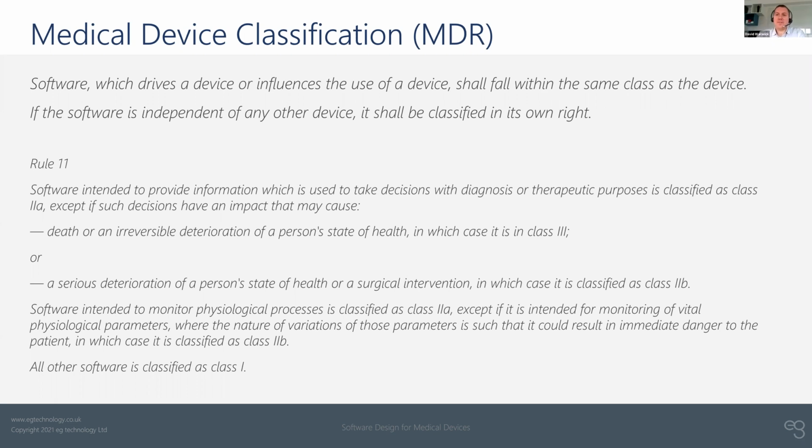I'm going to contextualize my question. I'm not actually working on a specific solution, but I am an entrepreneur amplifier. So I'm often working either with software engineers that come to me with health ideas or healthcare workers that come to me with software ideas. I want to encourage them, but my instinct is to get them to take this very seriously from the get-go. So my question really is, what is the very lowest bar a startup can shimmy under to avoid all of this? I'm thinking of examples like yoga for back pain, or the Calm app for stress management. Do they need to look at this, or where does that fall in the intended use?